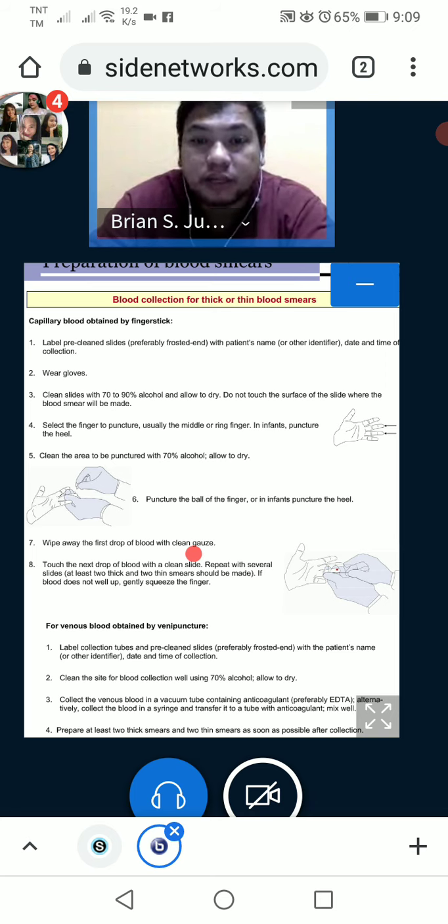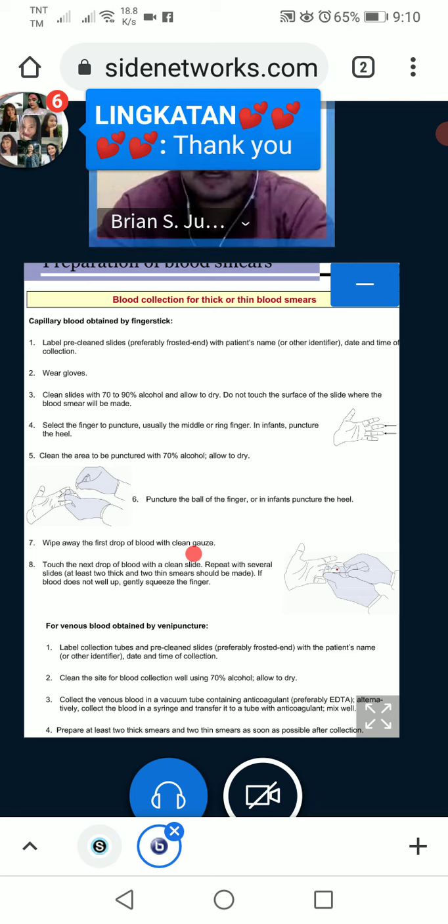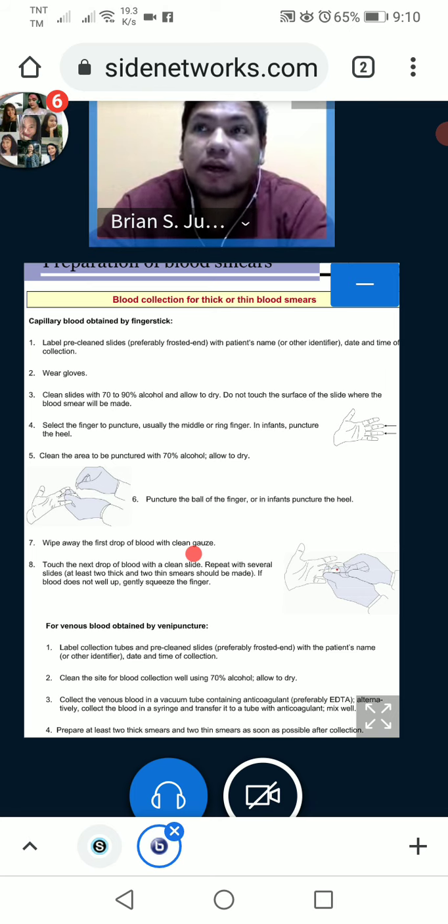Before class, this is when malaria is endemic in the Philippines. Maraming series of trainings ang pinerform or ginawa to accomplish this type of procedure. Hindi madali yung pag-collect ng smear, pero the diagnosis portion is mahirap. Bakit mahirap, sir? Pare-pareho po ang itsura ng malaria parasite na nasa loob ng ating blood.